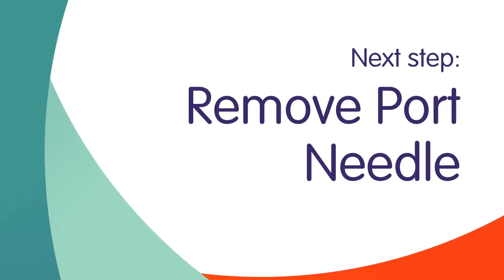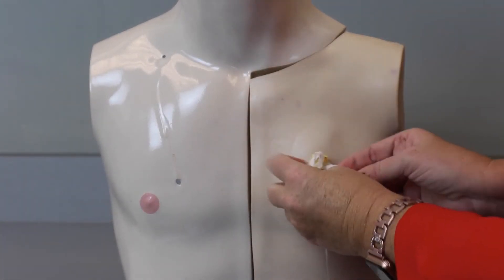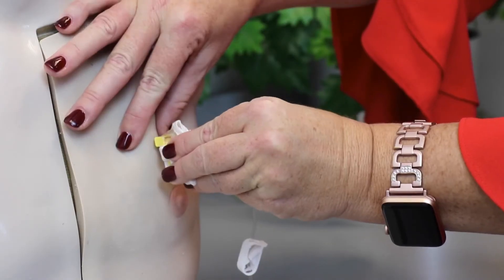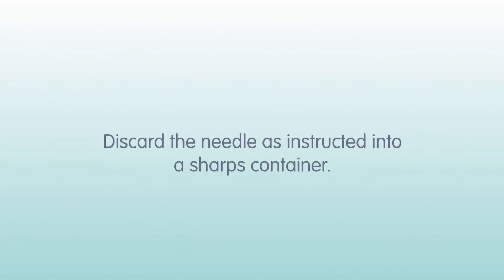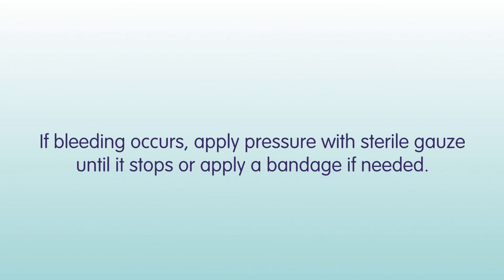You are now ready to remove the port needle. Carefully remove the dressing, holding the port steady with the fingers of one hand. Continuing to hold the base of the port, pull the needle up and out of the skin. You will hear a click indicating that the safety device has been activated. Discard the needle into a sharps container. If bleeding occurs, apply pressure with sterile gauze until it stops, or apply a bandage if needed.